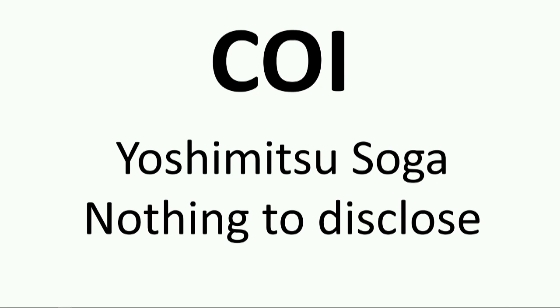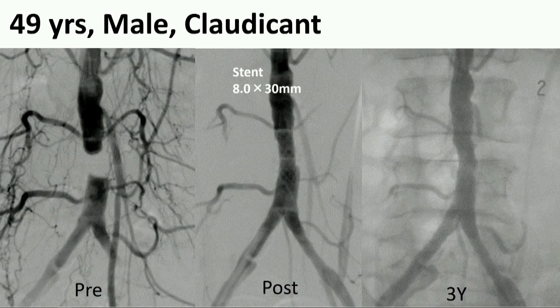This is my disclosure. Before talking about the topics, as you know, the primary patency after successful stenting is very, very good. At 5 years, more than 75 or 80% primary patency was observed.